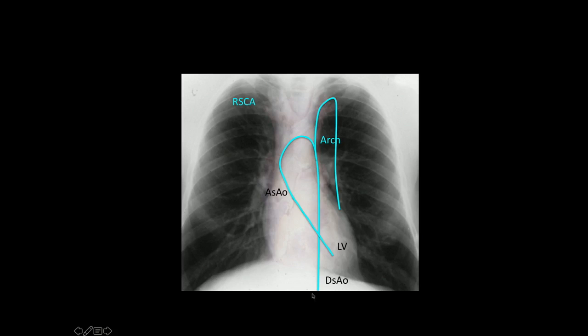And then here, if you're up the aorta and then you suddenly come down here and you're really anterior on the lateral, what'd you say? LIMA? Yeah, it's the left internal mammary. It's really anterior on the lateral, but this is where the LIMA is. This is where the RIMA is.